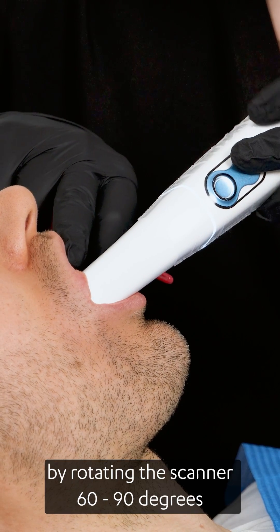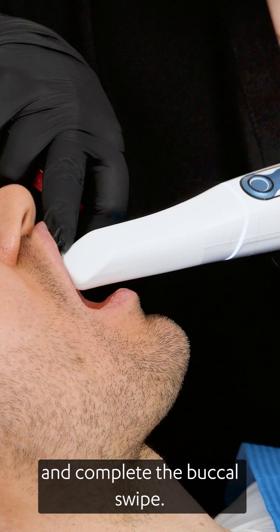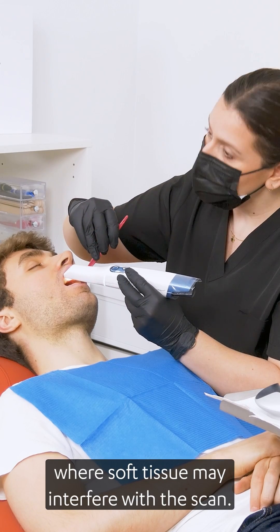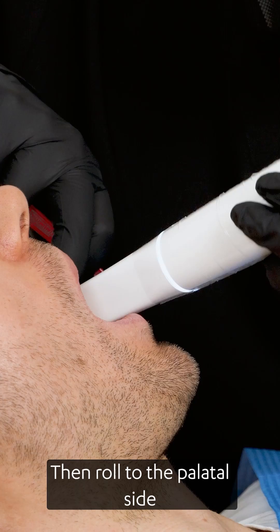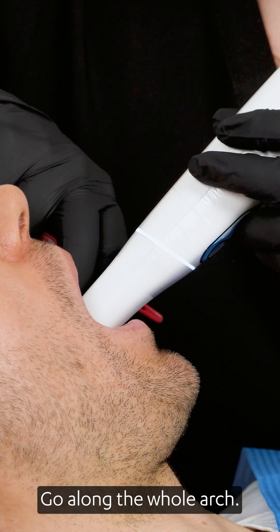Turn slowly buccal by rotating the scanner 60 to 90 degrees at the last molar and complete the buccal swipe, taking care first of areas where soft tissue may interfere with the scan. Then roll to the palatal side and complete the swipe, going along the whole arch.